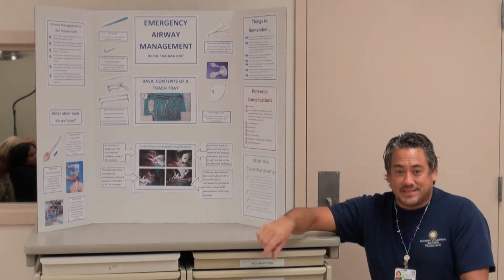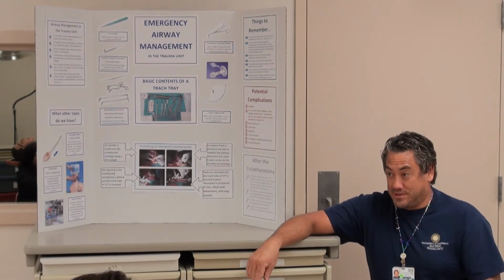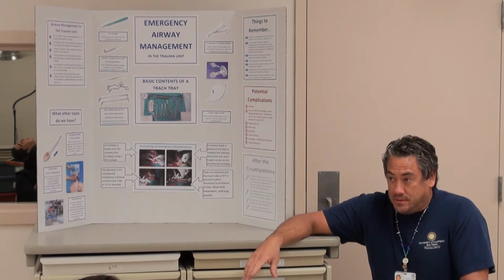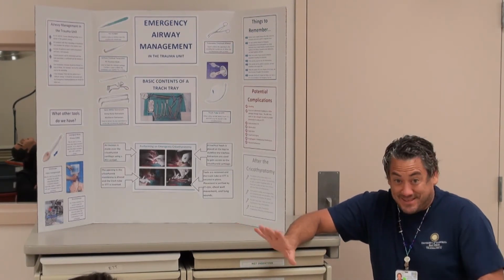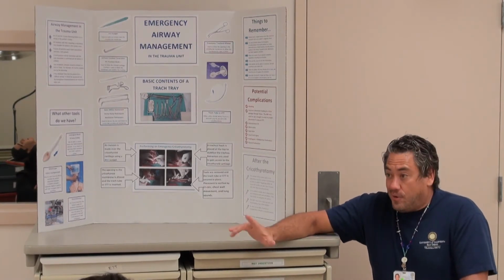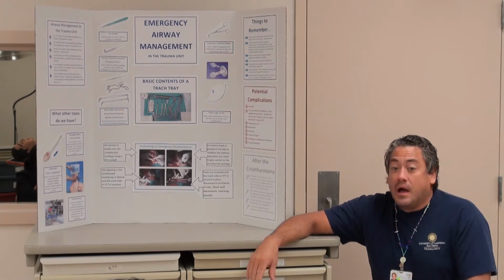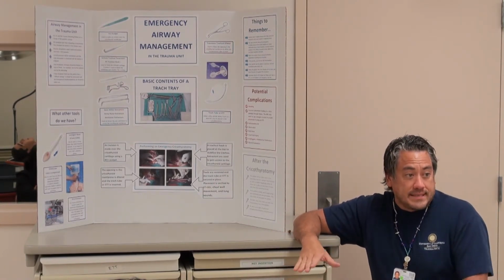In the past, they've asked us to hold the cricoid pressure. We weren't really sure what we were supposed to be doing, how hard to press, and where exactly to press. So they have said that it should be the fellow. It got to the point where we've had a couple of aspirations in the past. So it's supposed to be the fellow or the attending that's actually doing the cricoid pressure. You'll see Jeannie Lee come in there and she's really good about it. She says, I'm doing the cricoid pressure. But some of the other ones are a little more lackadaisical about it.